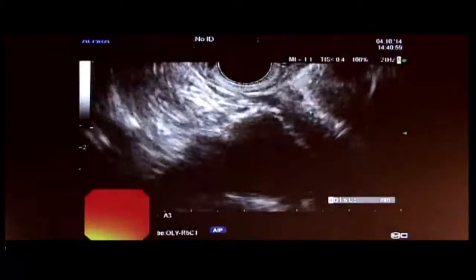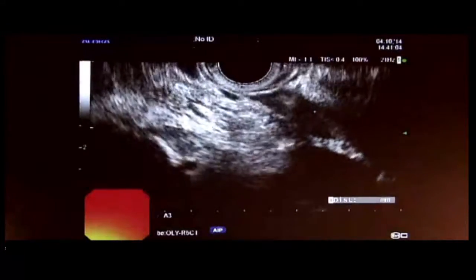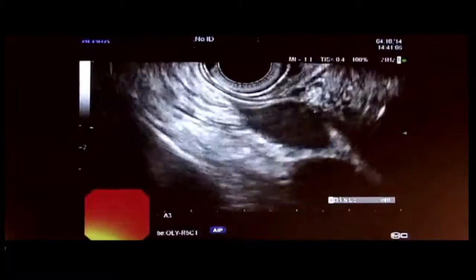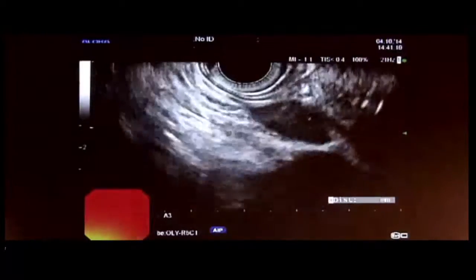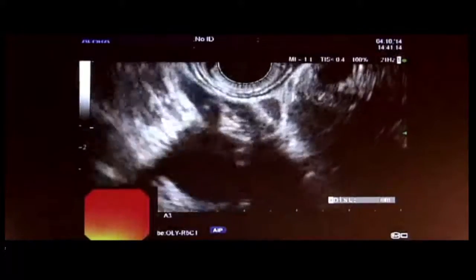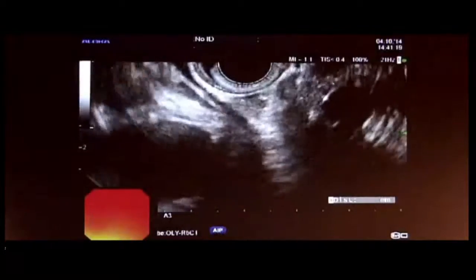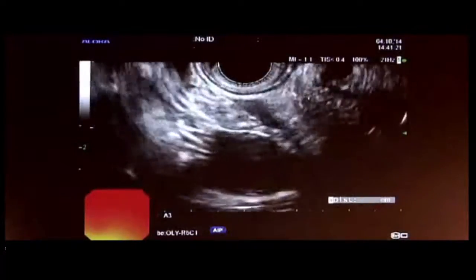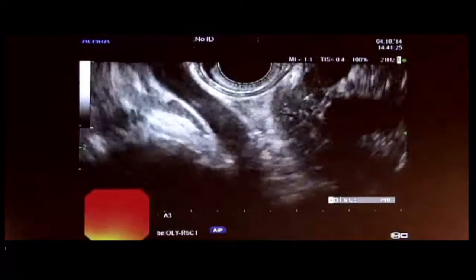When you hit the duodenum, of course, you get the folds of the duodenum and you start seeing the air around it. So this is the actual region of the papilla, the far right. I don't know if with a cursor you can show it there, across here. And then now I come into the orifice here, and there's a bile duct at the top, and right below it should be the PD. Now that's a vessel, that other structure. Let me just get the plane where we can see the PD again.